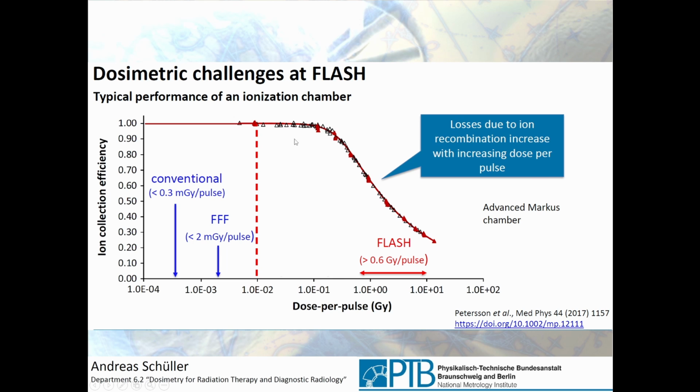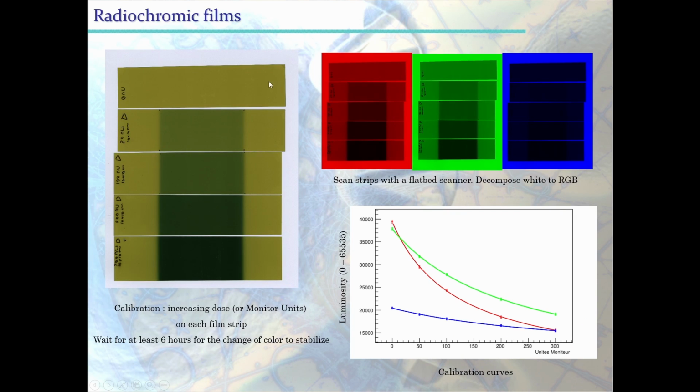And there you see a nice fit on the data points. So it's good. You can say maybe you can compensate, but no, it's really not easy to be accurate enough. You know that you have to be very precise when you are doing dosimetry. And you cannot play by compensating something which is too tricky, it's not accurate enough. So things have to be done. People are working on that, so you can do not real-time measurement for sure.